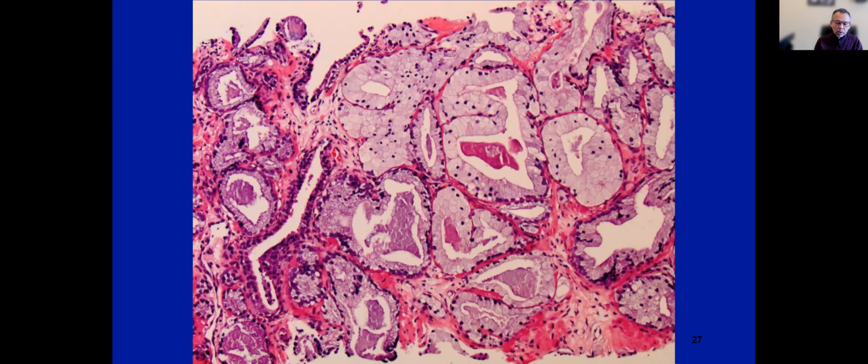It is also important to keep in mind that certain histological variations, particularly foamy gland cancer, pseudohyperplastic cancer, atrophic cancer, may look very subtle morphologically. They are characterized by very subtle nuclear or sometimes architectural atypia, and can easily mimic a benign condition.